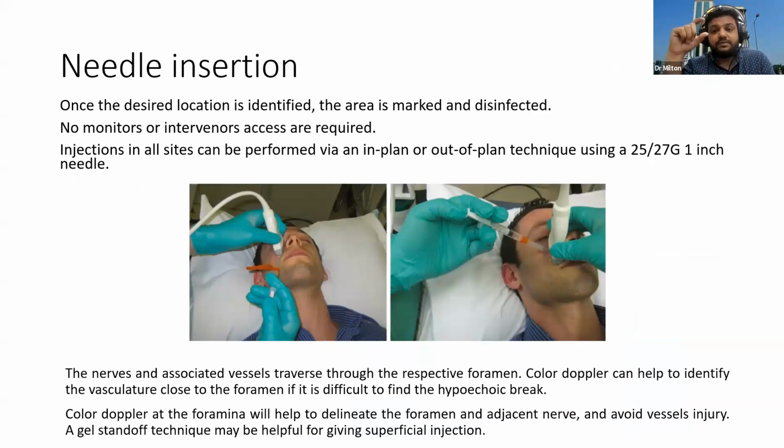If you pierce the blood vessels, sometimes they spasm, and many times there is bleeding inside. So it is better to give a small amount of local anesthesia, so you can identify the blood vessels very nicely, as well as the nerve just beside the blood vessels.